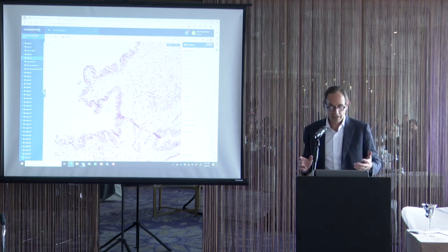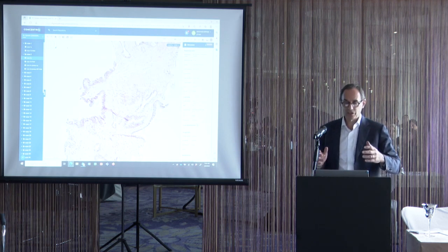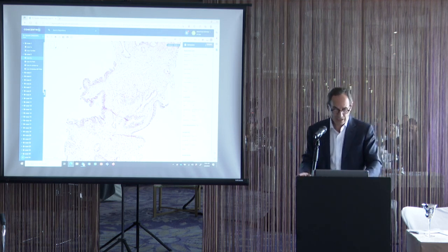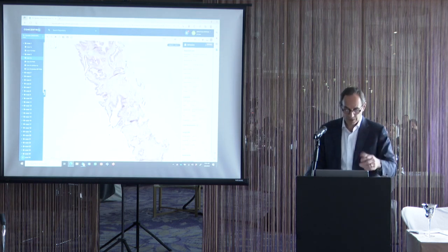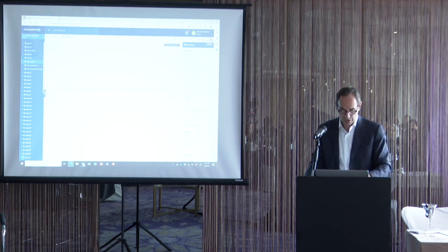So when I see that on a needle, as we talked about earlier, the thing to think is, could this be PIN-like ductal adenocarcinoma or a PIN-like cancer? Because PIN shouldn't be cystic like this. So in a case like this, you could raise the possibility of PIN-like ductal cancer on a needle, but you wouldn't be able to make a definitive diagnosis. So what you'd want to do is then do the basal cell stains.